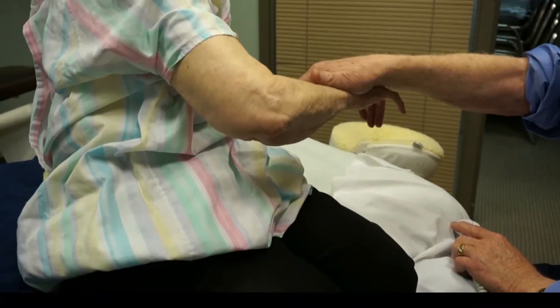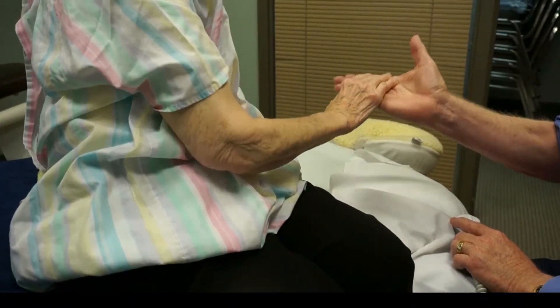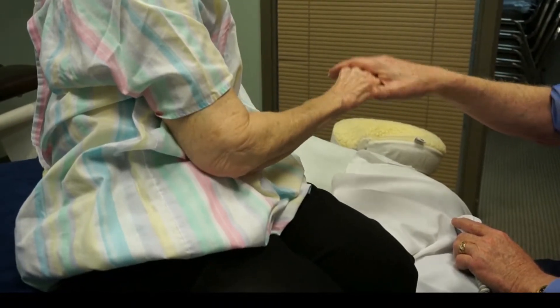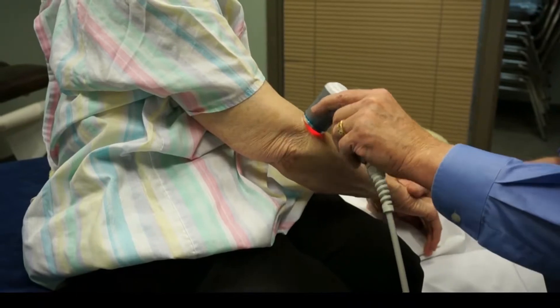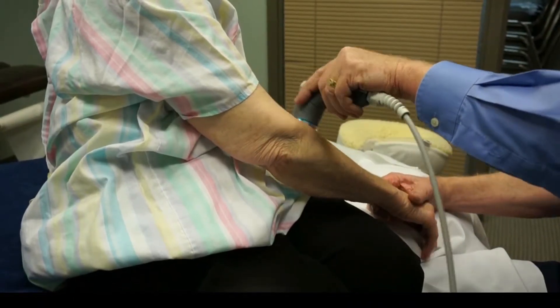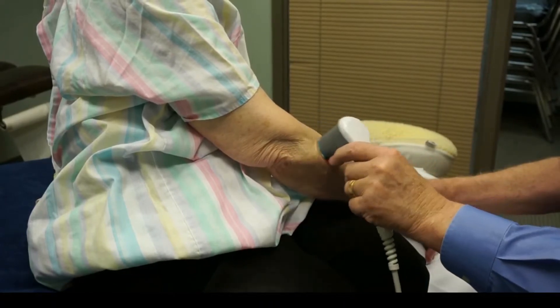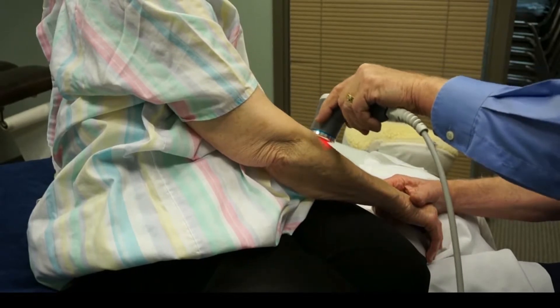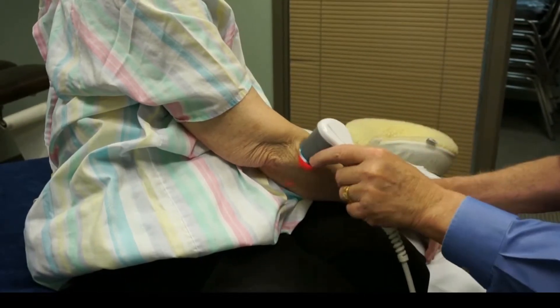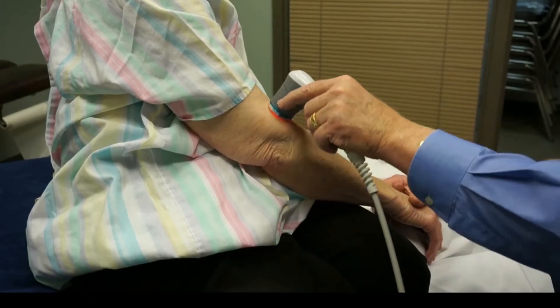Push up in the air, push down, push down on the fingers, and push up on the fingers. When you do that, understand that's not a test of strength — you always have the advantage over the patient. It's just manual resistance; you're looking for the area of pain. The circle overlapping circle technique works very well for this.